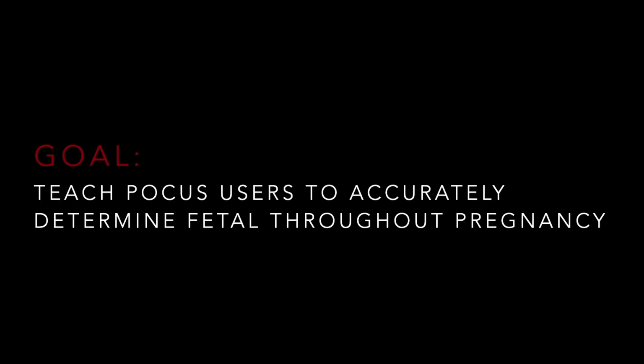And part of that workup in the trauma bay is assessing for fetal viability, right? To see if the fetus is alive or if there are some potential injuries there. And then also how far along that pregnancy is, right? Because that's going to really help us determine whether or not we need to assess them for a longer period of time versus just a quick ED assessment, make sure there are no compelling traumatic injuries and then discharge, right? So this becomes rather applicable for anybody who rubs shoulders, bumps elbows, whatever metaphor you want to use, with pregnant patients.